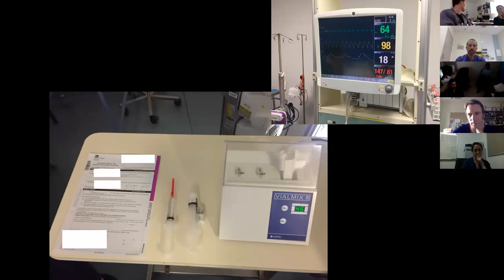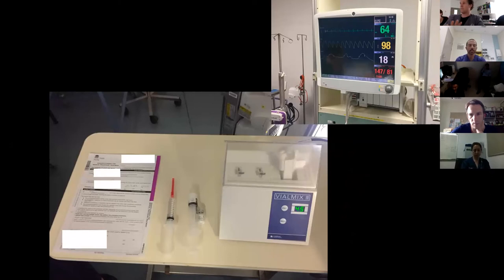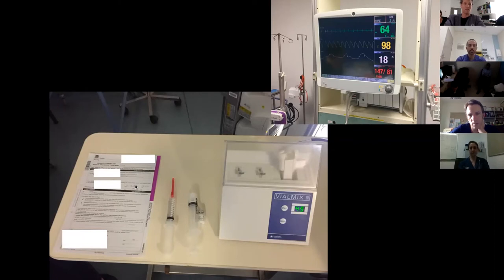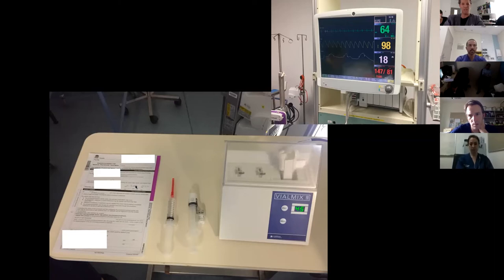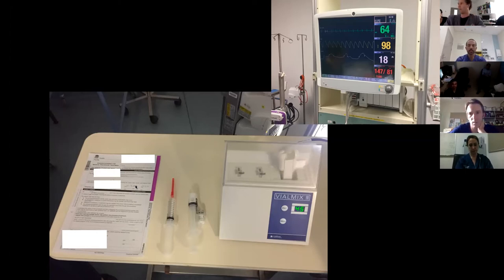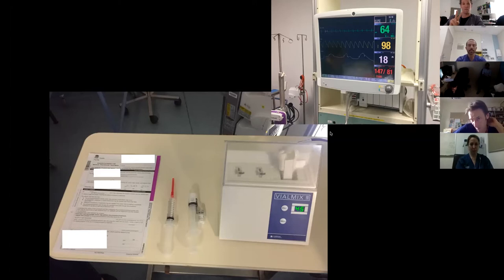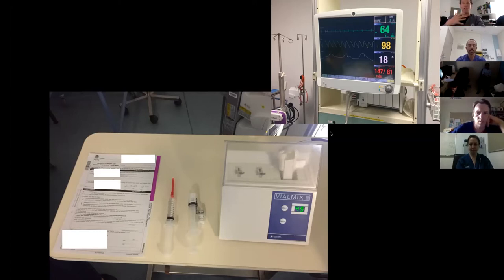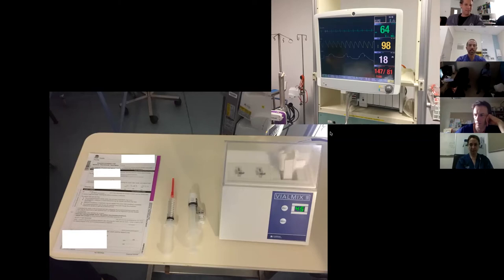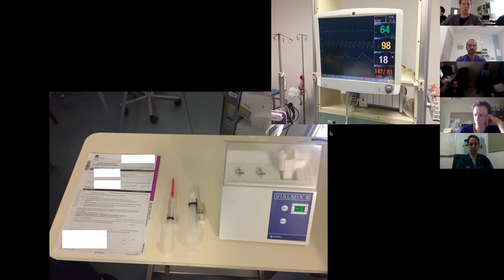To perform contrast echo: draw up the vial using the vial mix. Obtain consent, because there are risks of anaphylactoid or anaphylactic reactions — extremely rare, roughly 1 in 5,000 and 1 in 10,000 respectively. You need cardiac and respiratory monitoring for at least 20 minutes during and after the procedure. Minor side effects can include pressure or warmth in the pelvic region, lower back discomfort, tachycardia, and bradycardia.